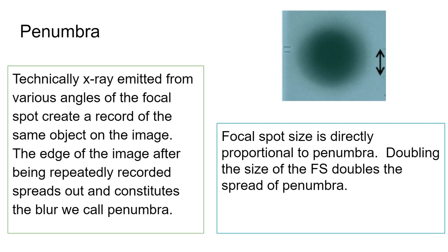You're still going from one side to the other, but you would have less penumbra and more umbra, right? It's kind of like if you have a donut and you change the size of the hole, make it bigger or smaller, but the outside is still the same, right? It's still the same distance from one side of the donut to the other, right? There's a diagram related to this near the end. So we'll go over this concept one more time.